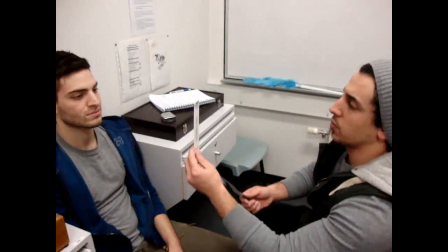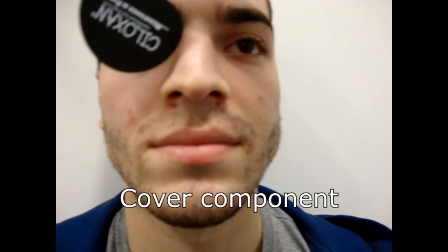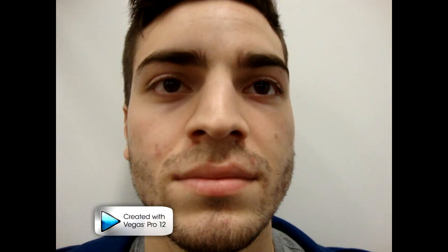Okay, Yusuf, can you please focus on the A on the top here while I perform the test? It contains 3 components. The cover component. This involves observing the movement of the uncovered eye to see if it takes up fixation. This brings out the manifest deviation.